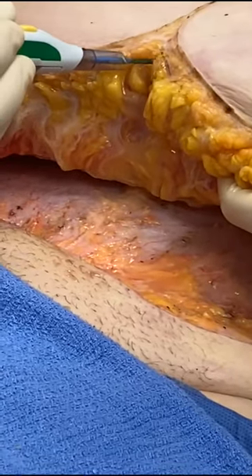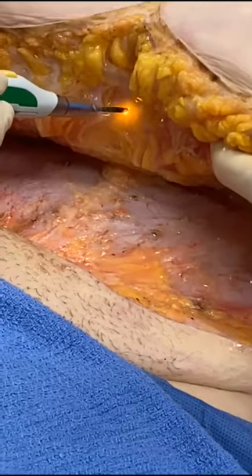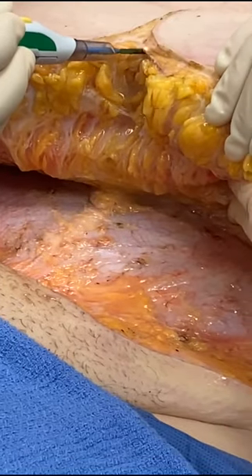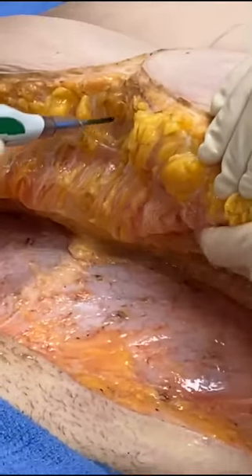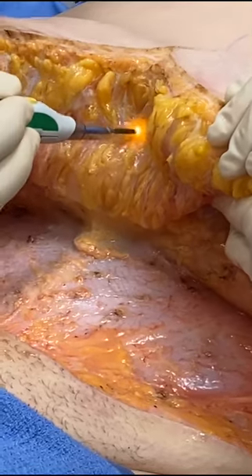If you go very fast, then they're gonna bleed, right? So you gotta set this instrument in the right settings. It's called an electrocoagulator, and just go slowly, right? And this is nothing fancy, you know. It's a little fancy instrument, but every surgeon has a version of it, right?